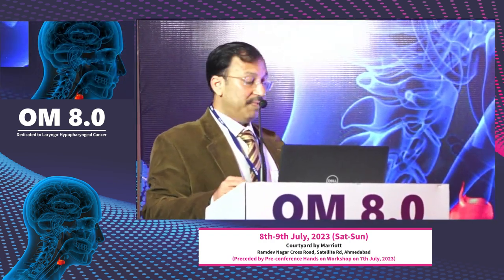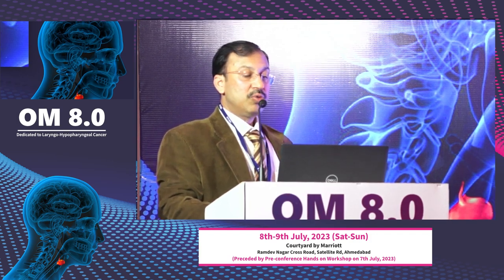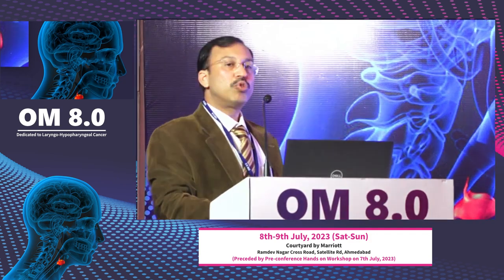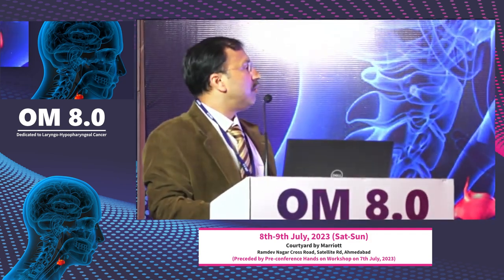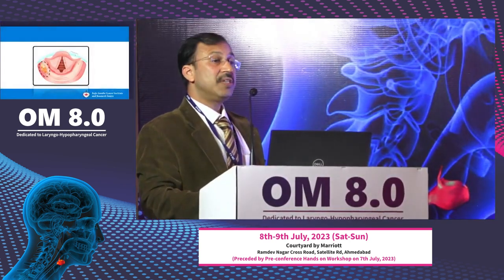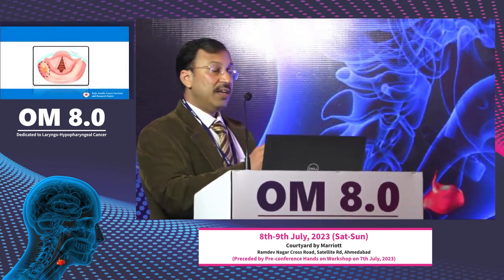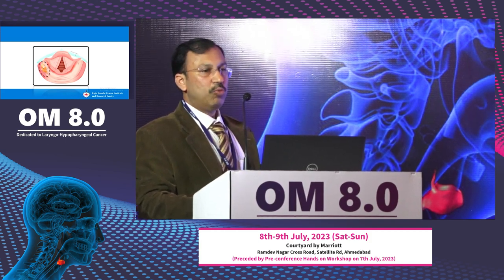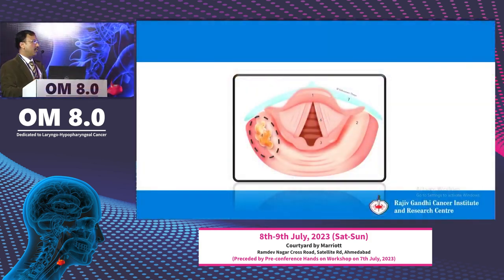Hypopharyngectomy, usually when we talk about it, we talk about the posterior pharyngeal wall, piriform sinus, and postcricoid areas. So if you see a lesion of the PFS, mostly if it's lateralized to the lateral wall, then you can go ahead and resect that. The medial wall will have its morbidity because you might have to remove the arytenoid and AE fold. So when you go for the lateral wall, it's meant for early lesions only, and exposure is a problem.